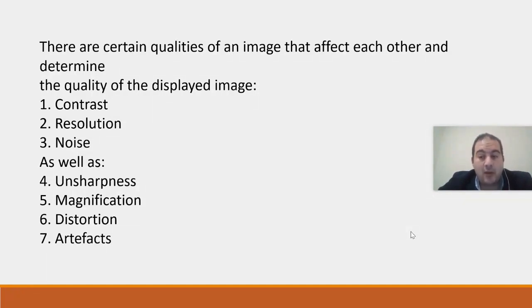The topic is about the complex and detailed process involved in determining the image quality, emphasizing that the ultimate goal is not just to produce a beautiful image, but rather to ensure that the image is diagnostic and meets all necessary standards. The integration between the acquisition parameters and a specific design protocol is crucial, and this also relates to the choice of machine specifications from the beginning, which is a critical step in the process.